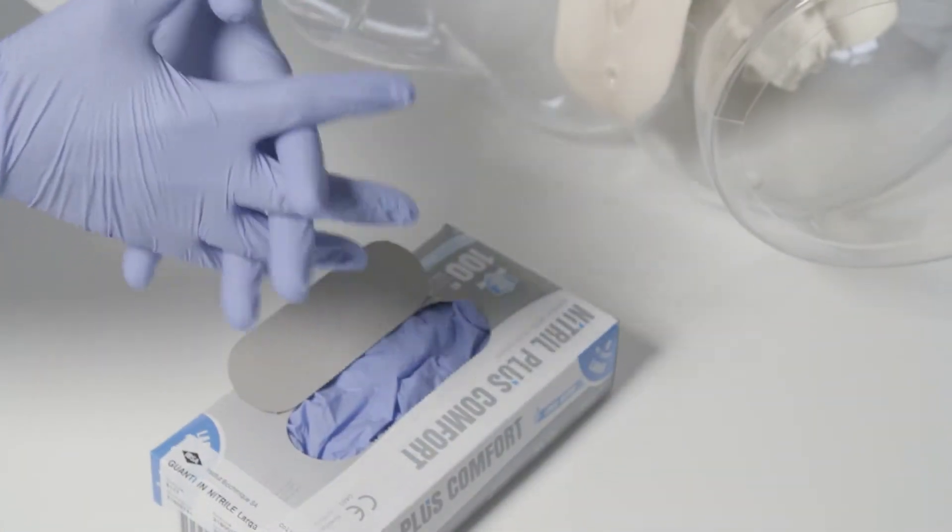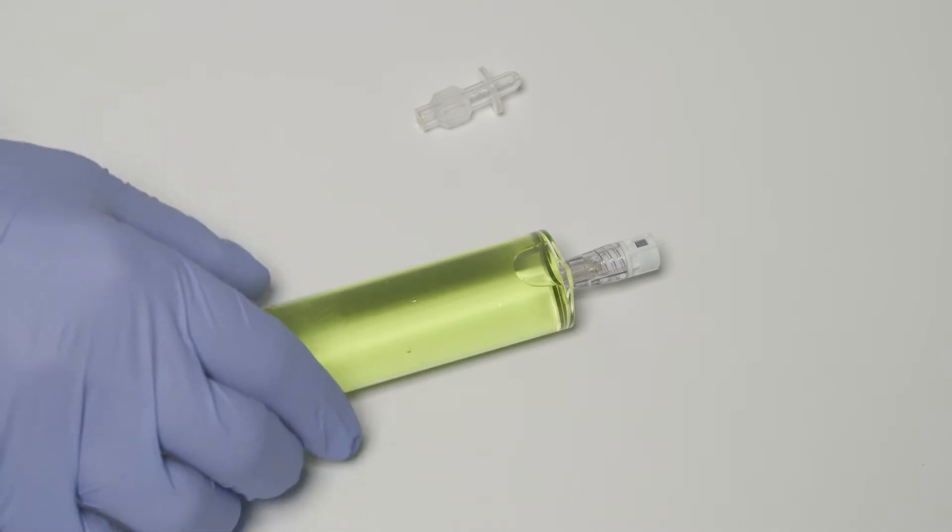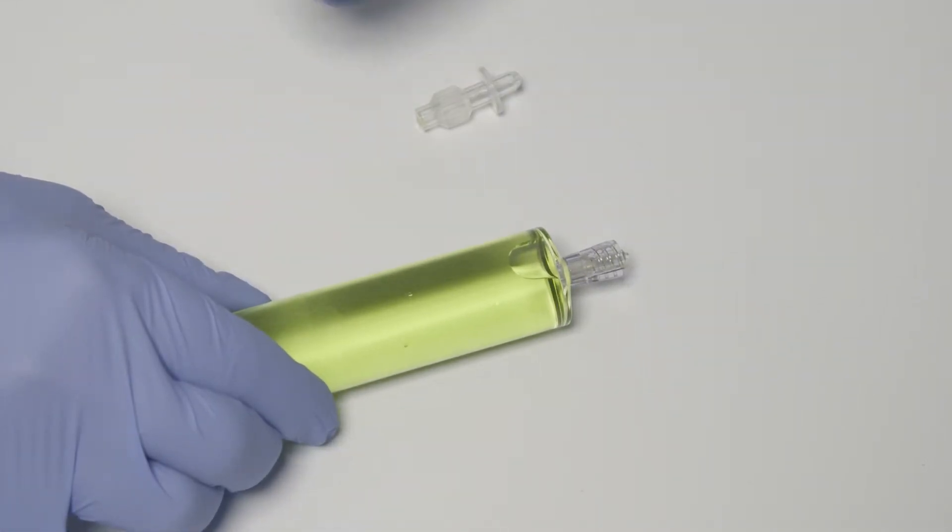I wear gloves for safety reasons. I connect the syringe piston and the yellow adapter onto the luer lock tip.